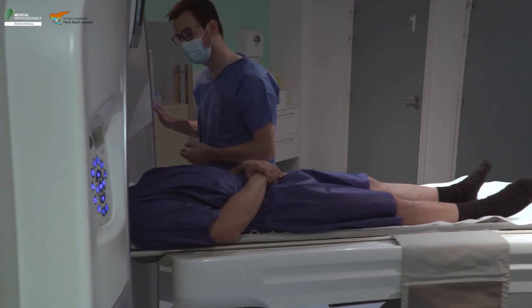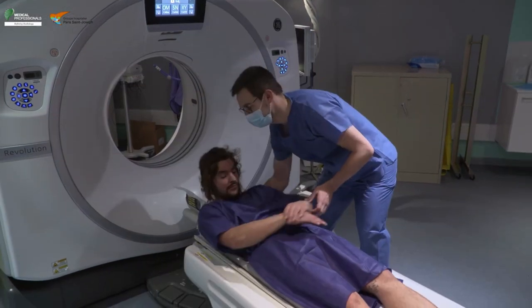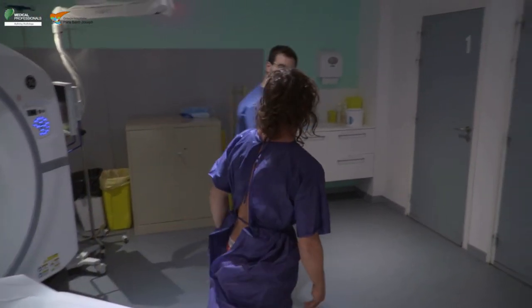At the end of the examination, accompany the patient back to the changing room and tell them that they can get dressed. Provide the patient with any post-examination instructions as indicated by your facility.